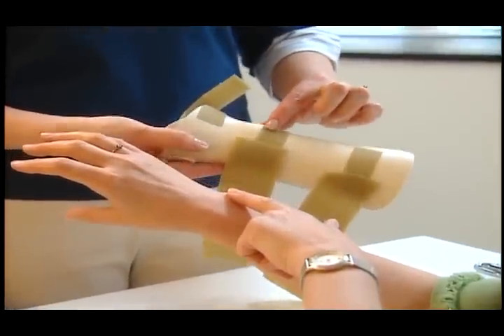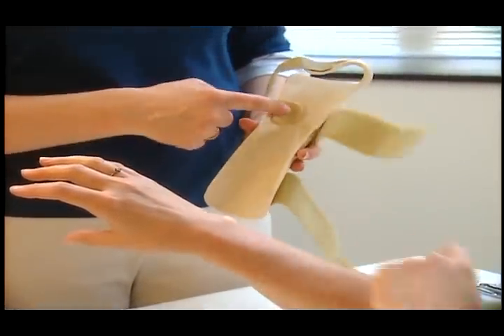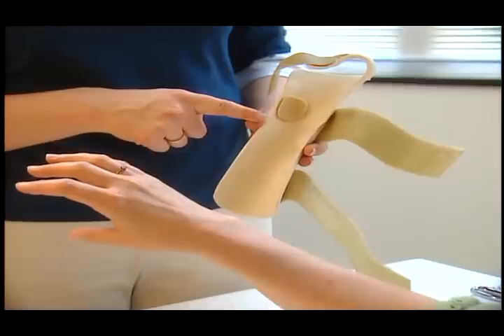Be sure to allow extra space over the bony prominences during the molding phase to prevent additional pressure once the padding is applied. When making a dynamic or static progressive splint, after the splint base is formed, the next step is to apply the outrigger or any attachments.